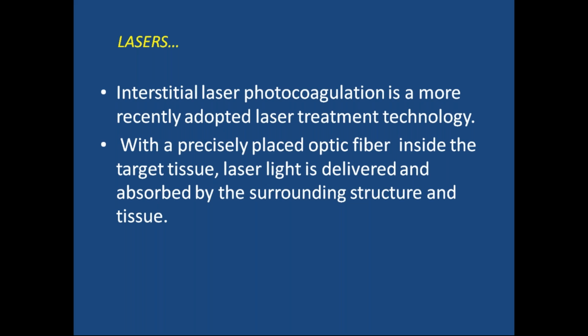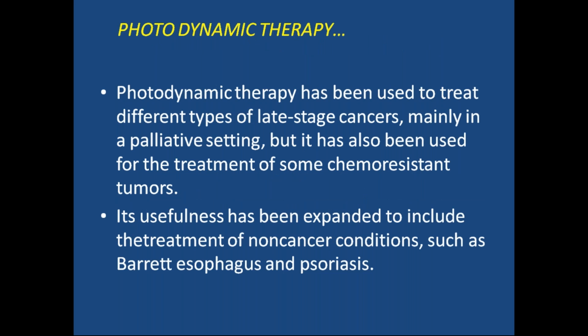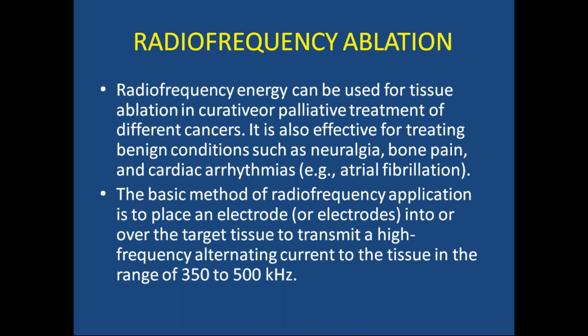So interstitial laser photocoagulation is a more recently adopted laser treatment. That much is not required, but you have to know the usage of this. Okay. Other is radiofrequency ablation. Energy can be used for tissue ablation or curative or palliative treatment of different cancers, neuralgia, bone pain, and cardiac arrhythmia.